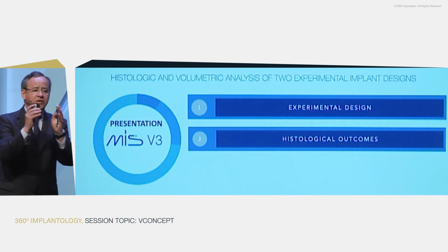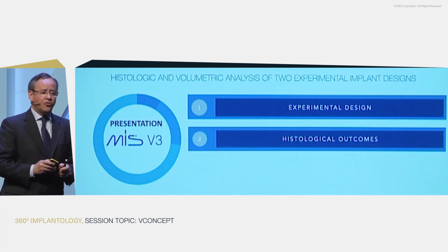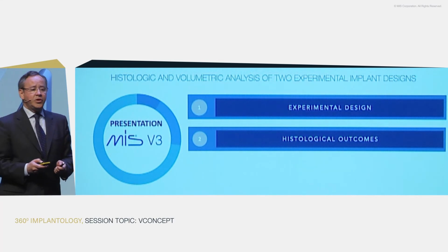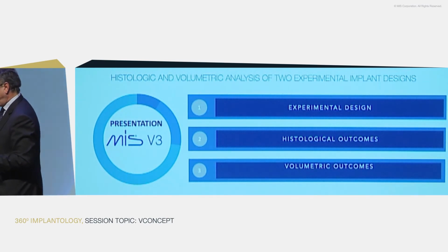But clearly the histology only provides us with a section in the center of the implant. Of course, it's very relevant because it's the buccolingual section that is of interest to us, but let us share with you the volumetric outcomes, and I give the podium to my colleague Ignacio Sanz.